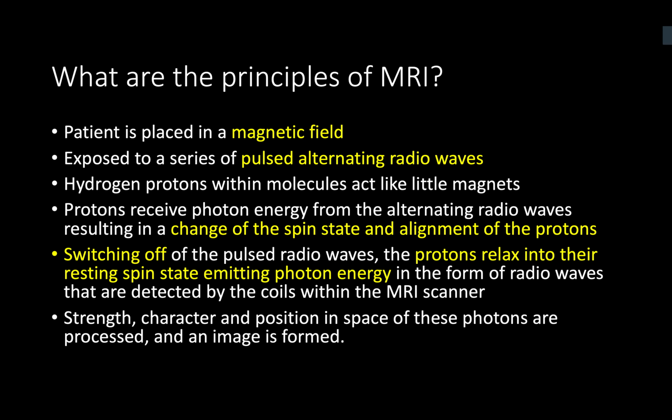So multiparametric MRI, the evidence around MRI before prostate biopsy utilized multiparametric MRI in the study. So talking about the PROMISE trial. And so the recommendation of NICE is to utilize multiparametric MRI. Okay, well done. What are the principles of MRI? How MRI is taken, and what's the action of MRI?